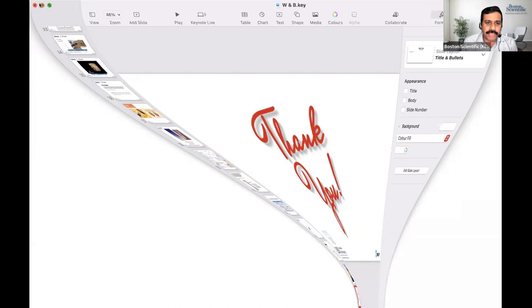And so one more question we have is, when do you use a J-tip guide wire? Is there any particular scenario in RIRS and PCNL? Yeah, J-tip guide wires, especially, are the ones where you would want to tackle these kinks in the upper ureter, especially near the pelvic-ureteric junction.